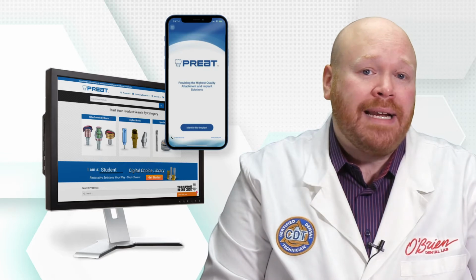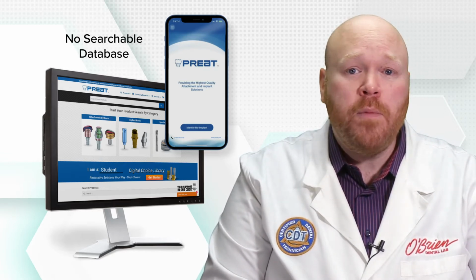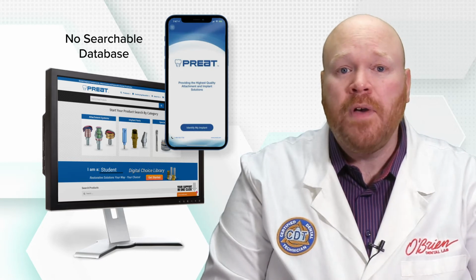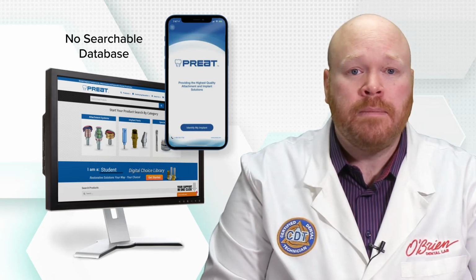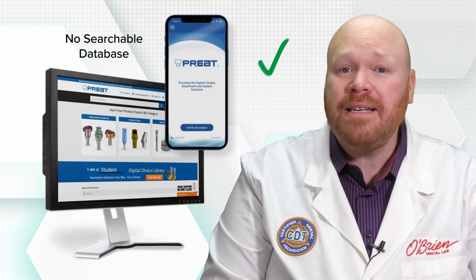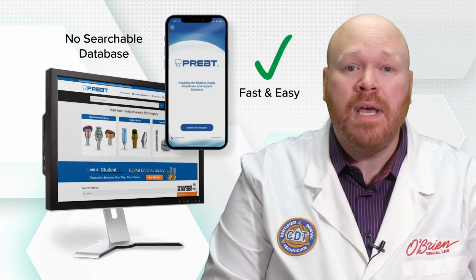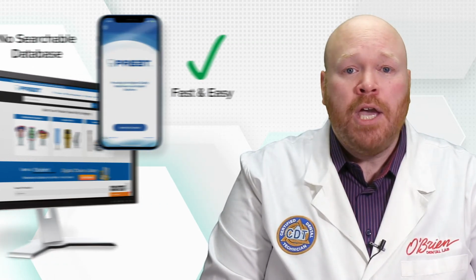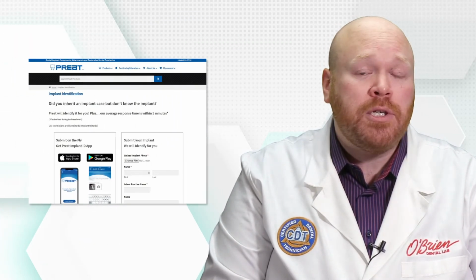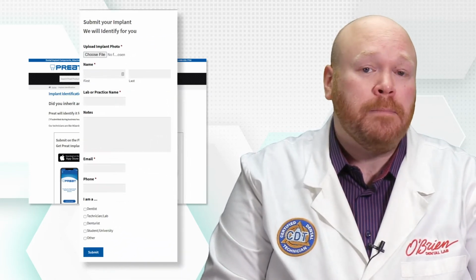Unlike the other implant identification sites, Preat does not have a searchable database, so if you prefer to try and determine the implant yourself, you will need to use another resource. That being said, when it comes to their identification service, it's fast and easy, and the ability to submit the request through both a PC and phone make it very convenient. You don't need to create an account to use this service, but you will need to provide an email and phone number along with the submission.